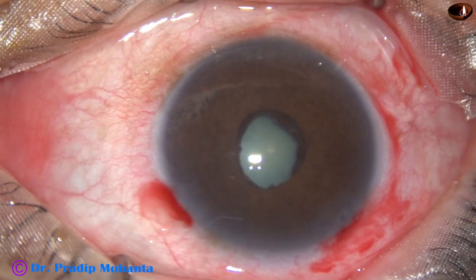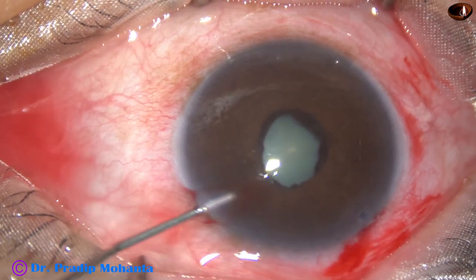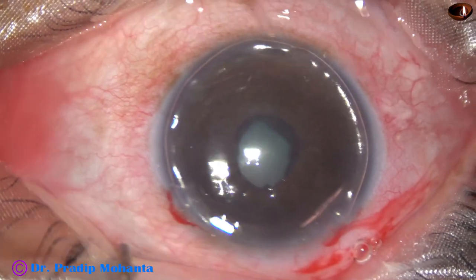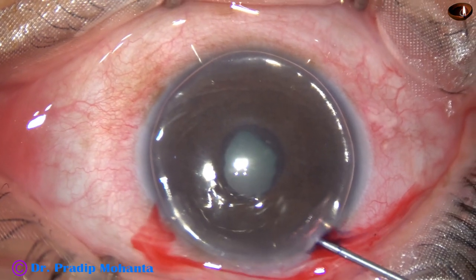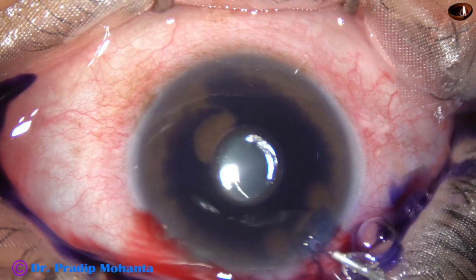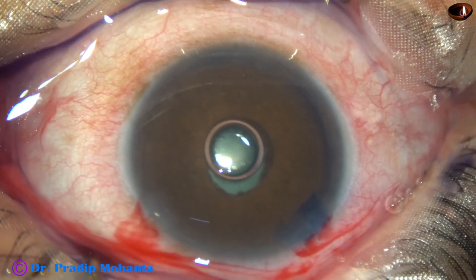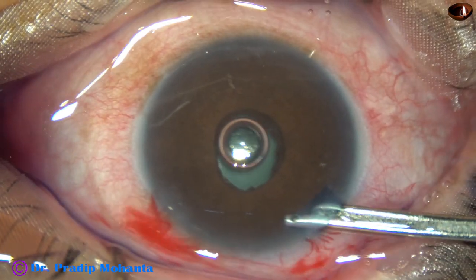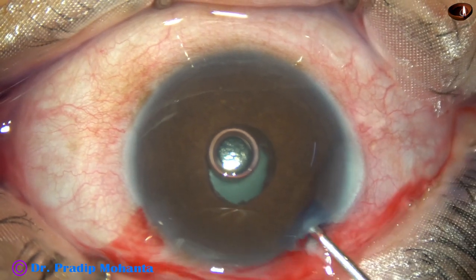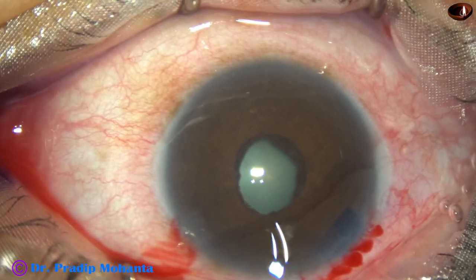Now an air bubble is injected, but there is some positive pressure in the vitreous and the air bubble is not getting retained nicely. So we inject some dye through the peripheral iridotomy. There is some membrane around the margin of the pupil and the size of the pupil is still small, about 2.5 millimeter.